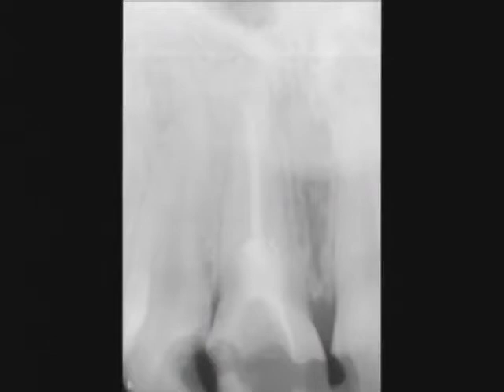Reviewing the radiograph, we can see the requirements that are going to be necessary from our treatment for the implant placement. And we have good lateral bone and above the anterior aspect of the implant. We'll be securing our fixture to give it some initial stabilization.